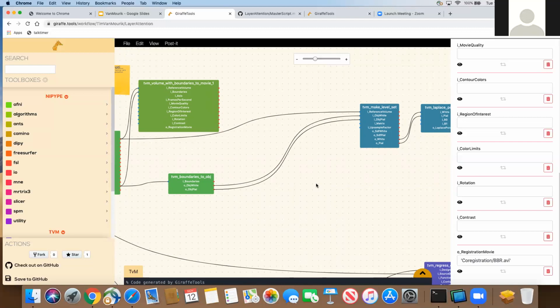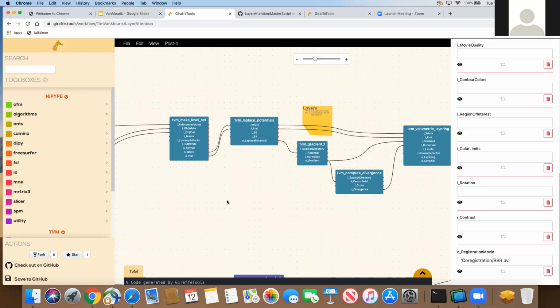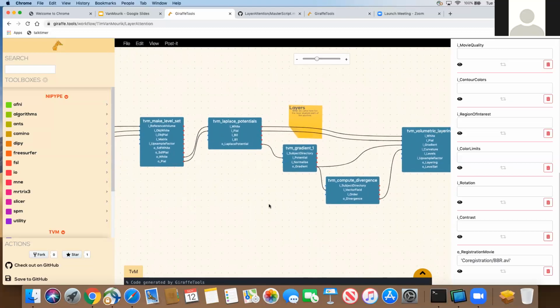subjects, for example. And one last thought, registration. I think it's important to talk about this because this is the most challenging step. Yep. So I think it's deserving.